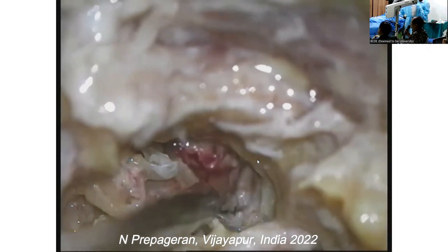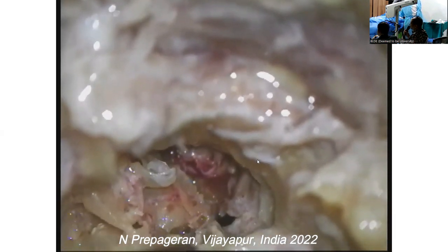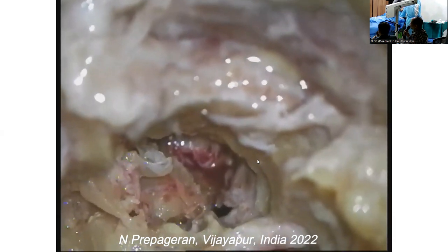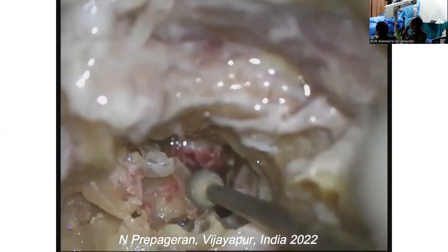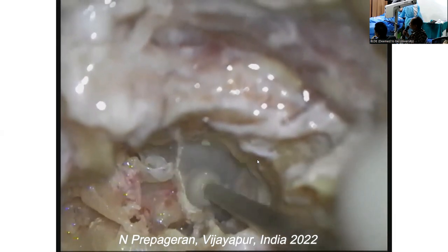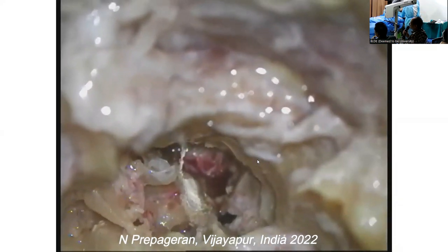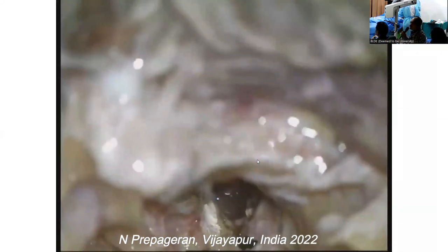So, like I said, this is a skull-base demonstration. This is not for temporal bone. So what I'm going to do, I'm going to open the cochlea now. But for the junior PG residents, you won't see a better demonstration of this carotid-jugular spine anywhere. It is this obliteration that gives rise to Phelps.